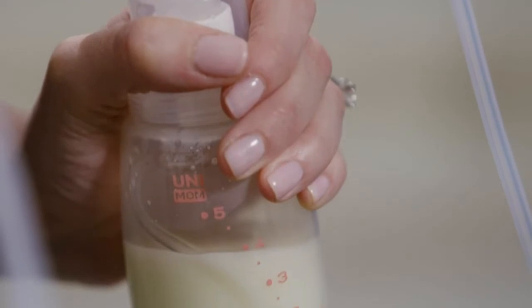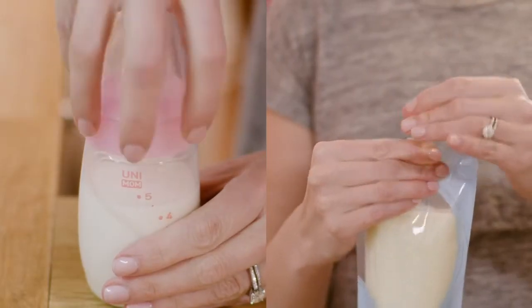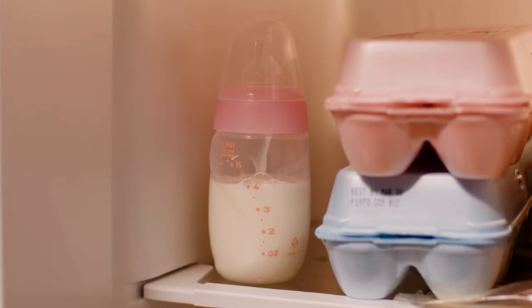After use of the pump, cleaning starts with storing the milk safely. Cap the collection bottle or seal the collection bag. Then label it with the date and time and place it in your refrigerator, freezer, or cooler.